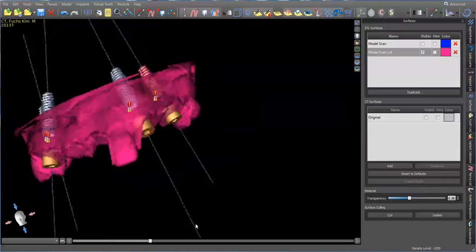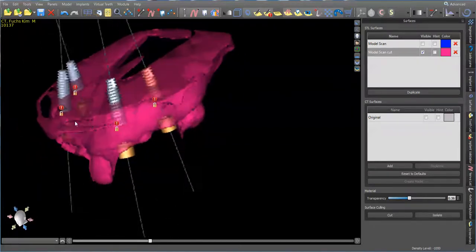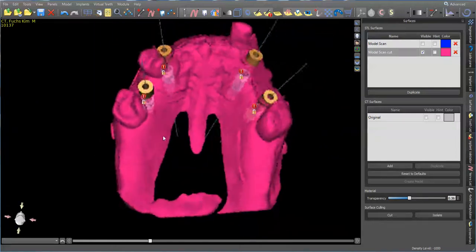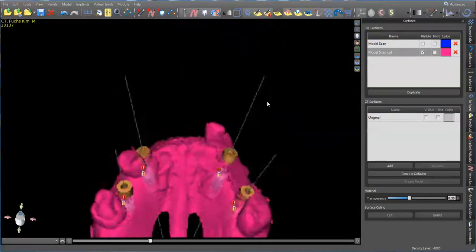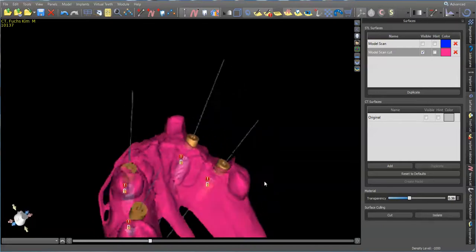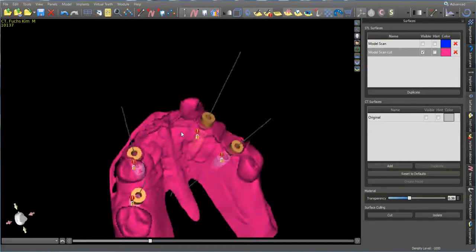So I have this, I'm not worried about that. I'm not worried about that lip. Alright, so let's go back and review this one more time. What I'm doing is, if you cut too much into this tooth, it won't seat properly, but if you don't cut enough, it's quite the opposite. It'll still seat, regardless if this is taken out or not.